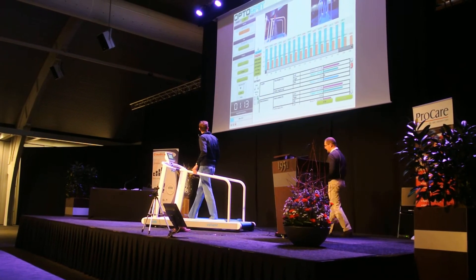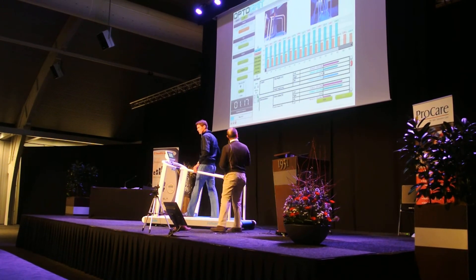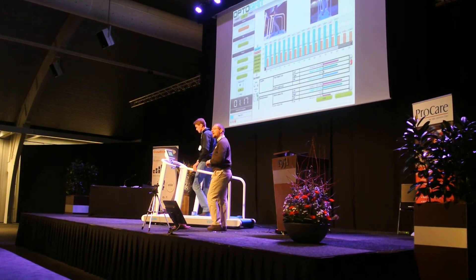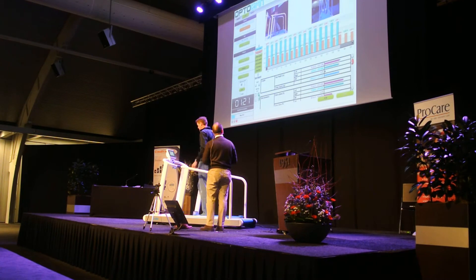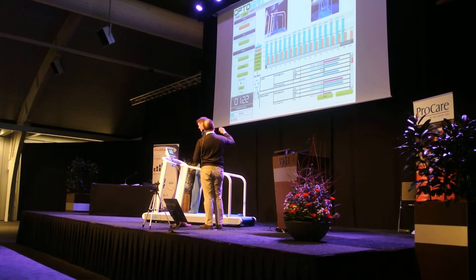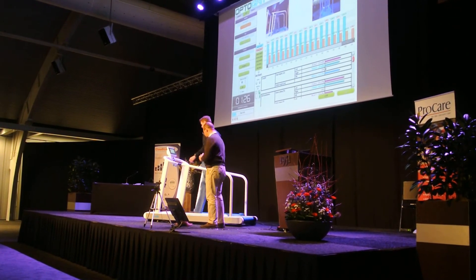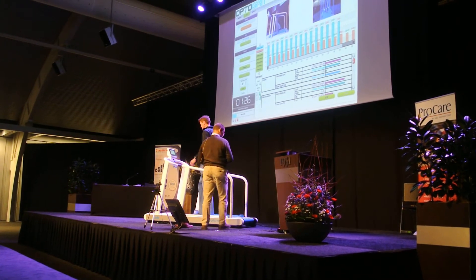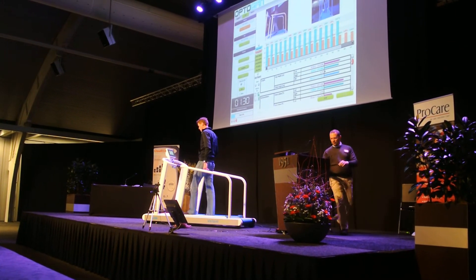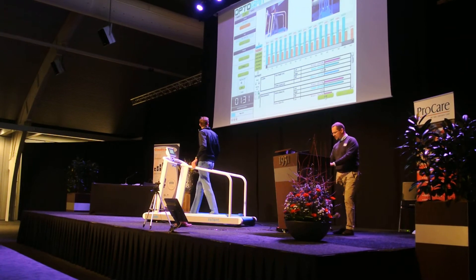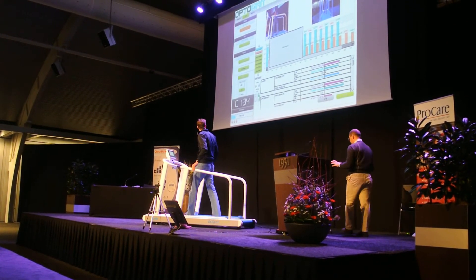Of course, the subject is watching the screen, so we have a nice asymmetry on the step length — 8.5% — and let's say below 5% variability. So now we did our test, 1 minute 30, more than sufficient. We stop the test and we have the result.